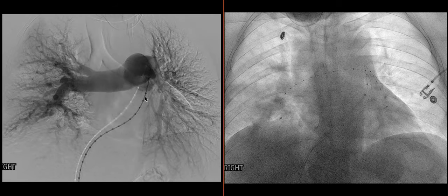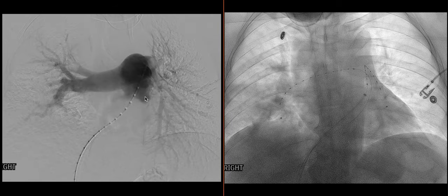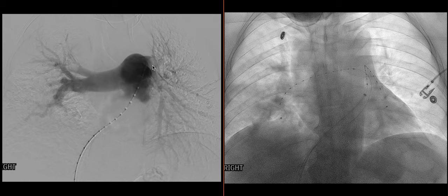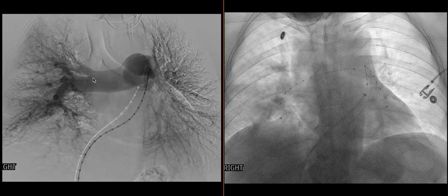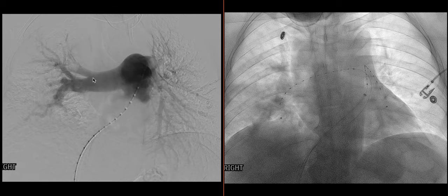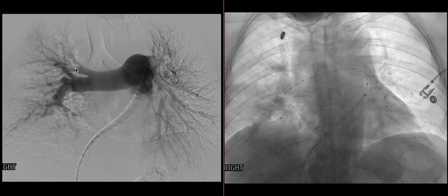This patient has very high PE burden, especially on the left. They have very central clot that goes through all the lobar, segmental, and subsegmental arteries on the left. We can see very poor opacification of the pulmonary arterial tree with filling defects all the way to the left pulmonary artery. Similarly, but not as bad on the right, we have filling defects of arteries going to the right upper lobe.